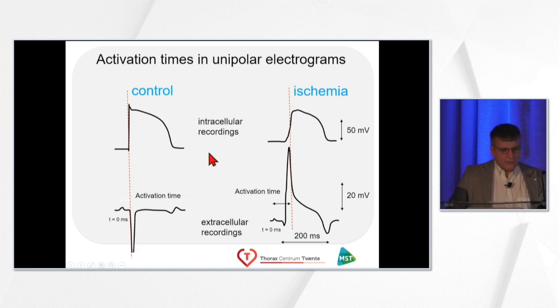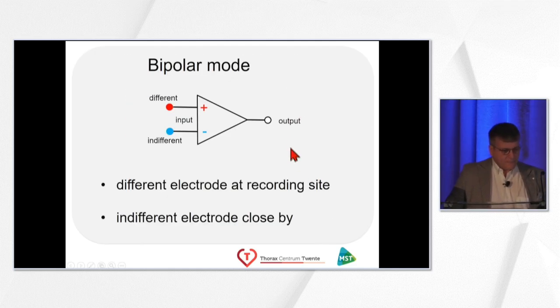And what was even more important, if you created pathological conditions, for instance ischemia, then the action potential is really distorted, and the unipolar electrogram is bizarre, but again, the principle that the steepest negative part of the unipolar electrogram coincides with the upstroke of the action potential still holds true. So it's a quite robust method of determining the local activation time.